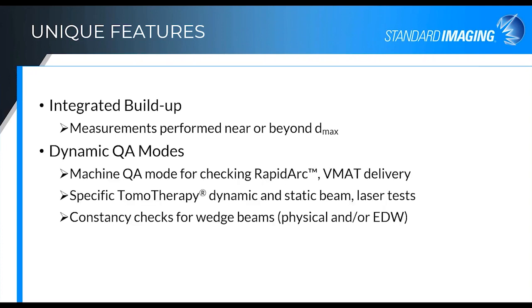There's also several dynamic QA modes so that you can apply a dynamic beam and apply your RapidArc or VMAT deliveries and get a daily checkout on that, as well as a specific tomotherapy mode, both dynamic and static, and also doing laser tests. I'll show you an example of that in a little bit.